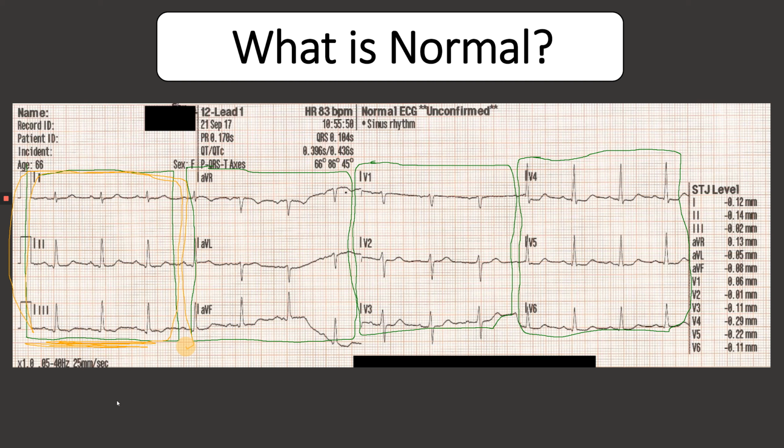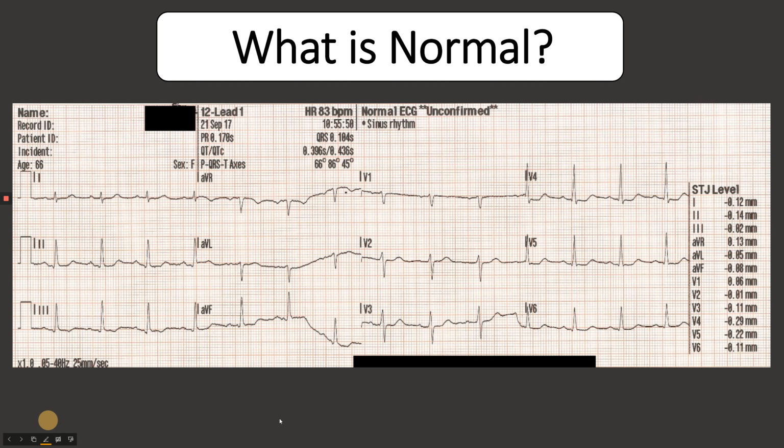So that's good because if for some reason, let's say lead 1, I got a lot of artifact, can't really make out what's going on, you can look in lead 2 and 3, and maybe you have a better point of view of what's going on in the heart. It's just kind of a little pro tip for you right there that you can enjoy.